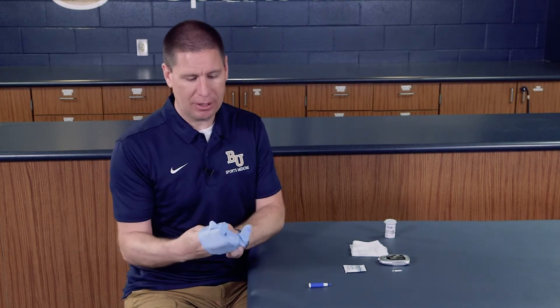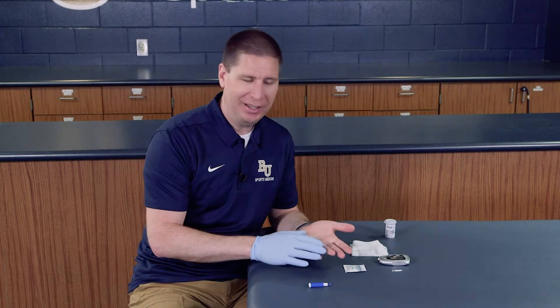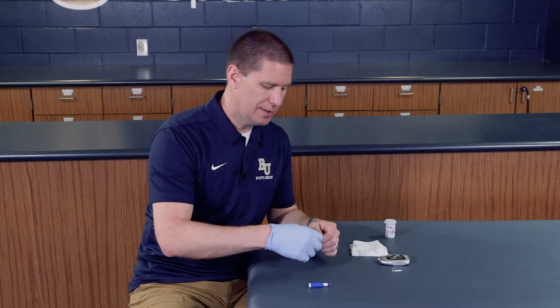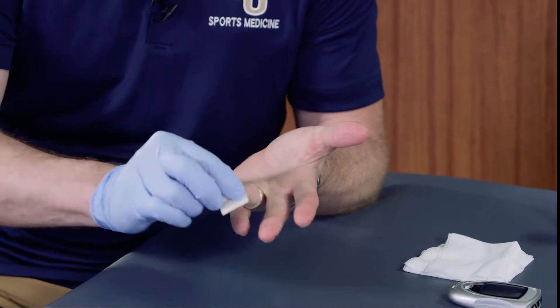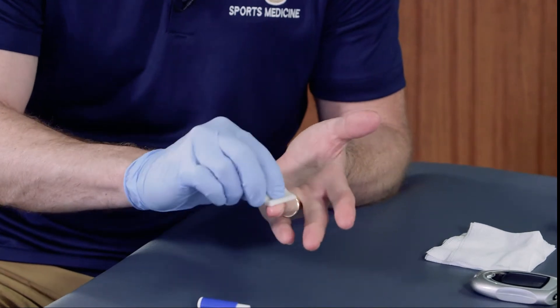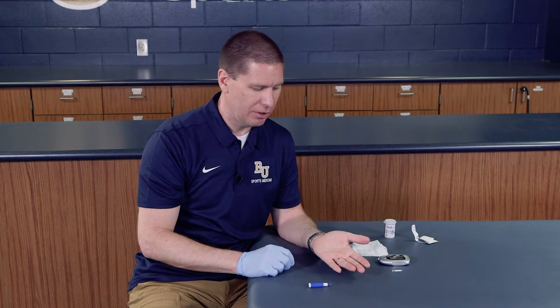I'm just going to demonstrate it on myself. In a normal situation I would place gloves on both hands, but I definitely need to have access to get the reading on the other hand. One of the things that would be helpful is to disinfect the area to make sure that there's no dirt, grime, or germs over the particular area. I'm just using an alcohol swab to clean that particular area.